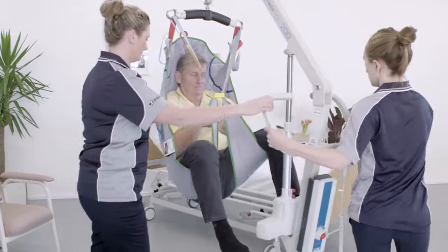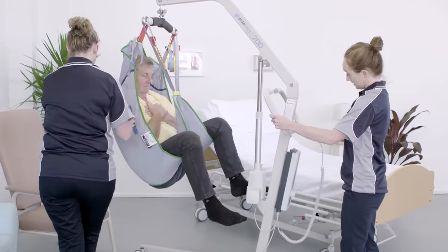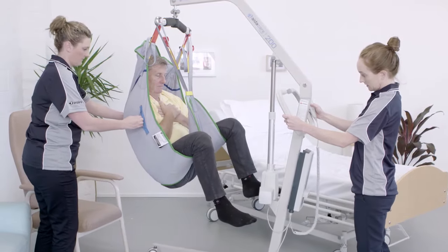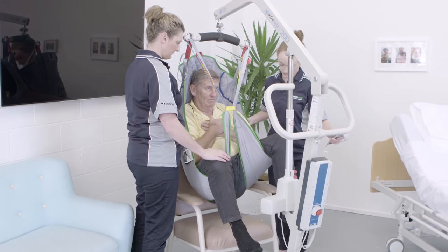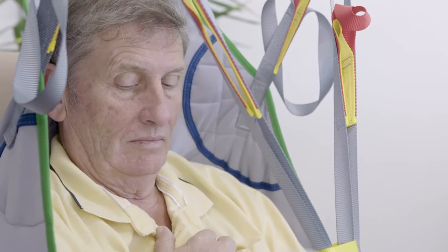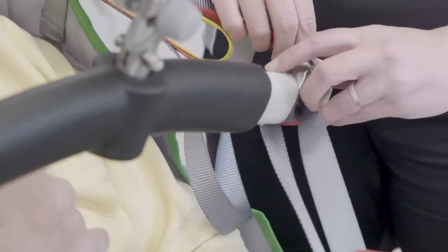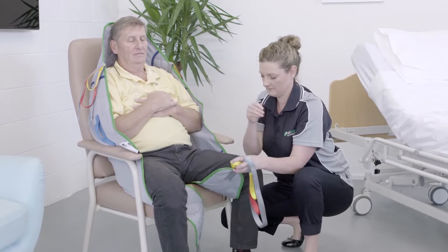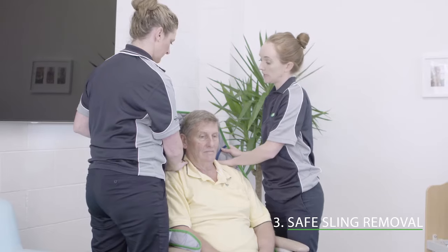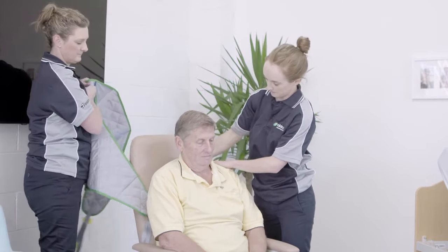Remember, while one caregiver is controlling the lifter, the other should be protecting the resident and ensuring they do not come into contact with the lifter, causing accidental harm. When the resident is at the desired destination, guide them as the lifter is lowered. When sitting safely, ensure that there is enough slack in the sling straps and carefully detach the sling from the lifter, making sure the spreader bar doesn't come into contact with the resident. Take the lifter out of the way and remove the sling. Notice how the sling's material is gently being folded back, not pulled or dragged — this care will help to avoid skin tears that cause harm to your resident.